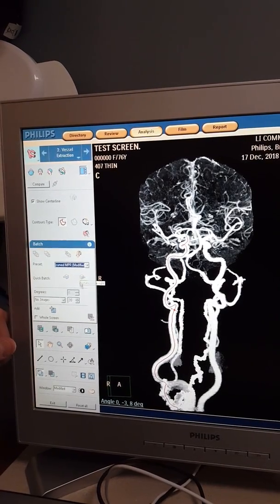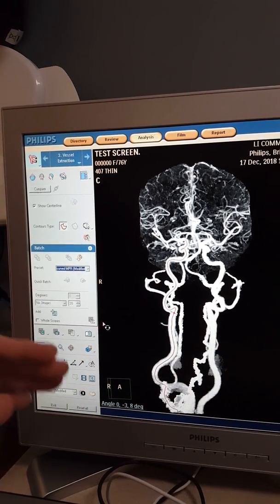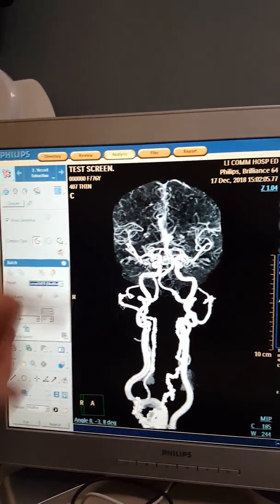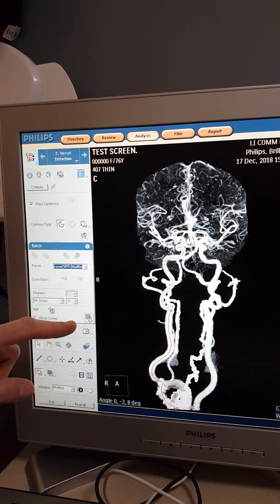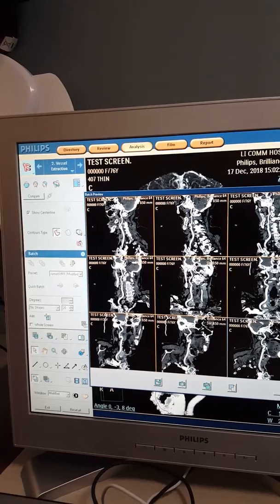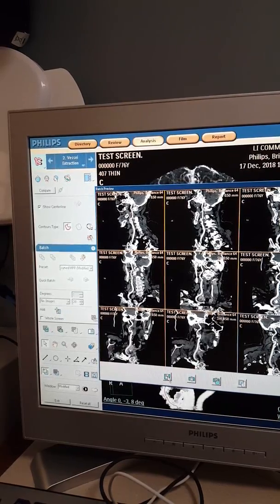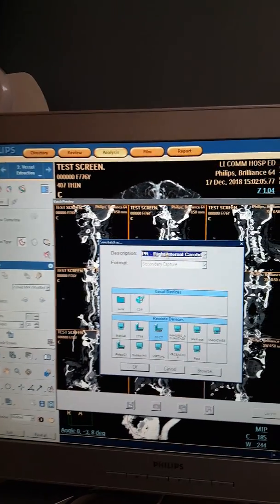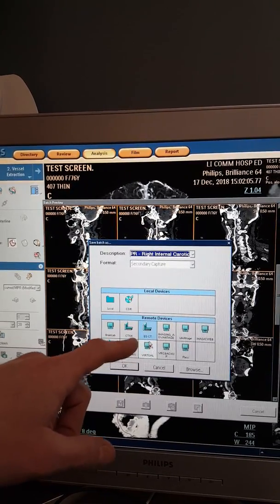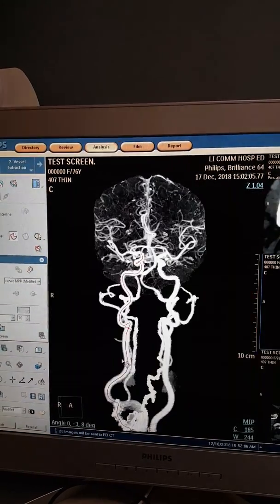You want to make sure it'll actually focus in on the vessel. It's going to work if your middle box or lower box is selected — if the top box is selected it won't work. You can preview it — you can see the vessel turning around, it looks good. We can save from here or from the other save area. Click save — you don't have to name it, it's already named. The destination folder should already be set to EDCT, then click OK.